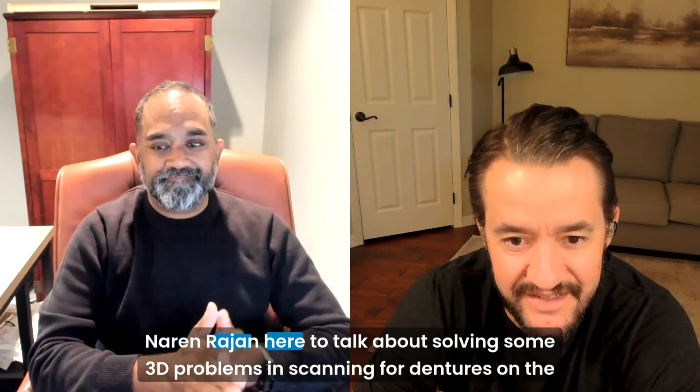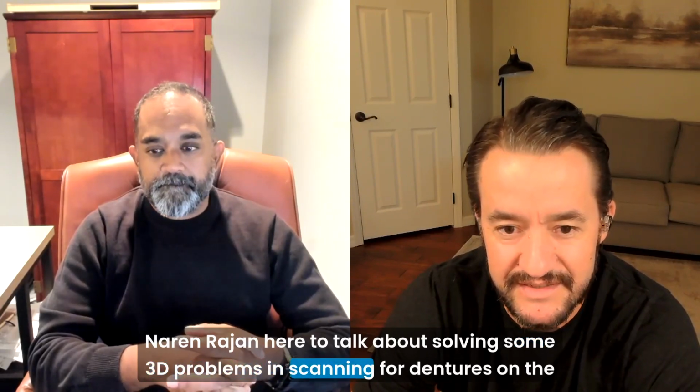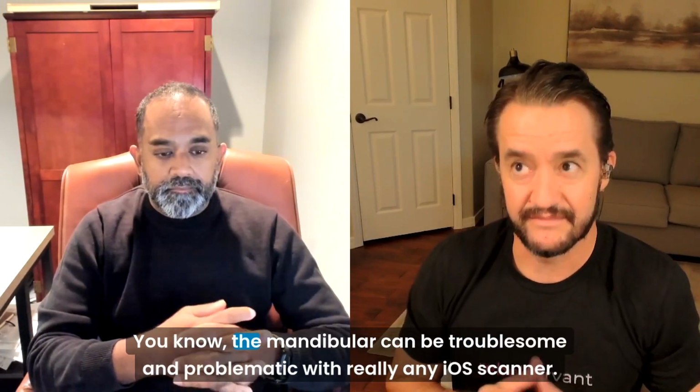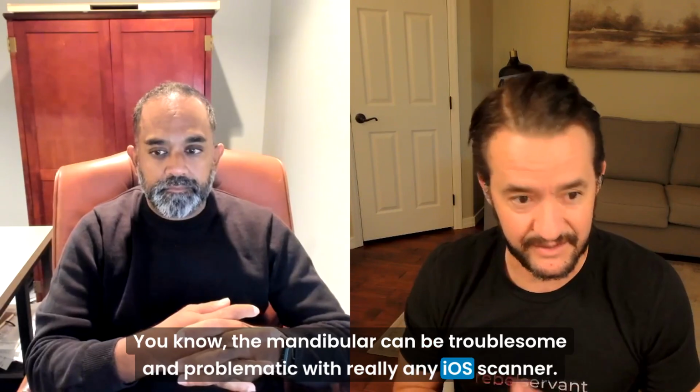Hello, everyone. Rob Azure and Dr. Naren Rajan here to talk about solving some 3D problems in scanning for dentures on the lower arch, the mandibular arch. You know, the mandibular can be troublesome and problematic with really any iOS scanner.